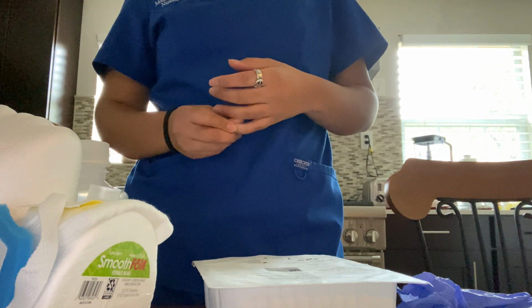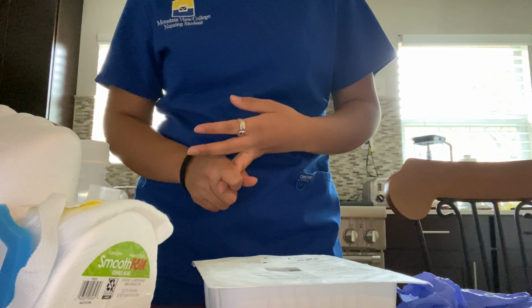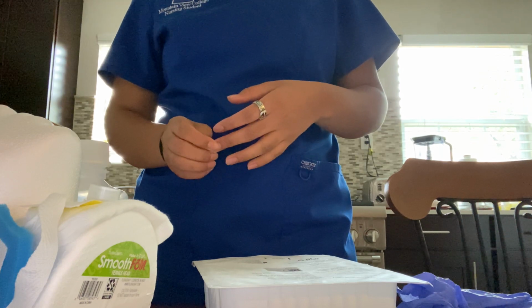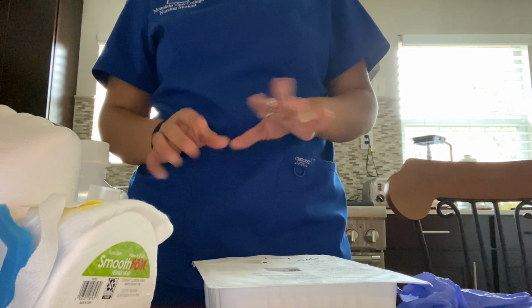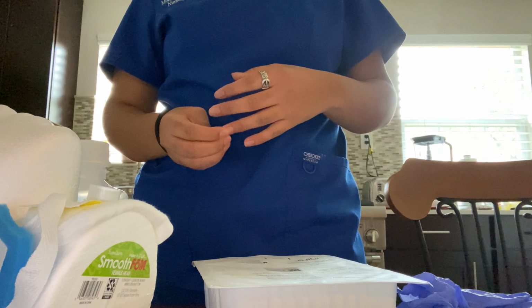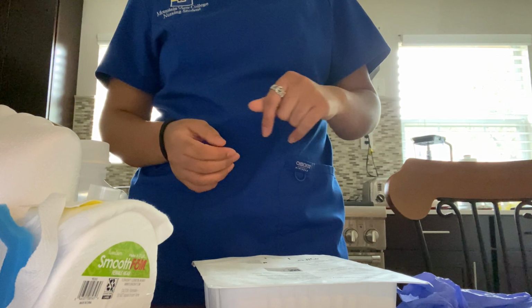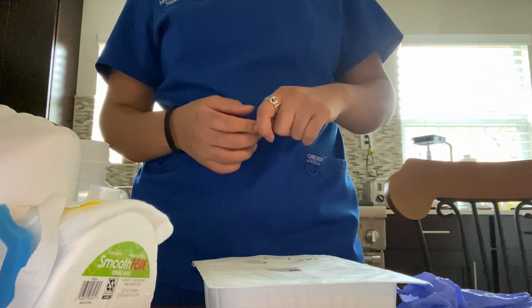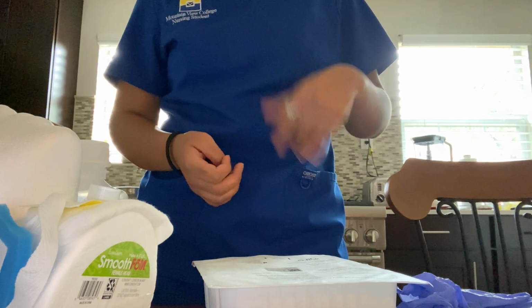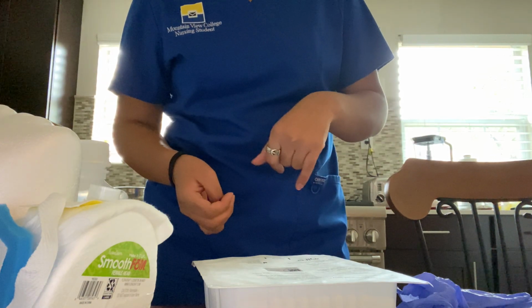Before you start, you're going to assess their vital signs, their pulse oximetry, and you're also going to auscultate the lungs. After you have obtained all the vital information, you're going to make sure that they know what you're going to do. You're also checking to see if their oxygen percentage is low. If it's low, that means you need to clear the airway to give them better oxygen.